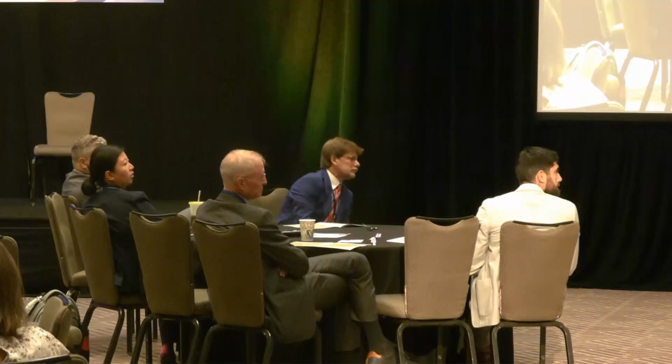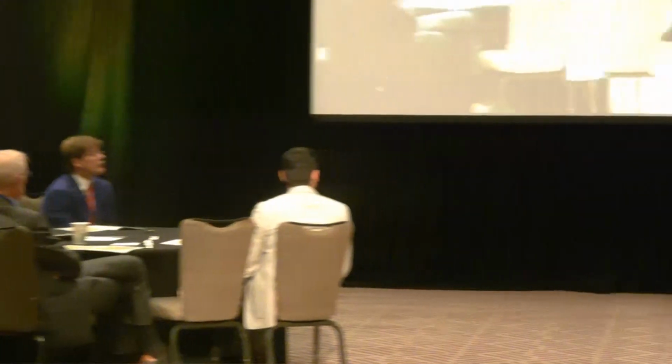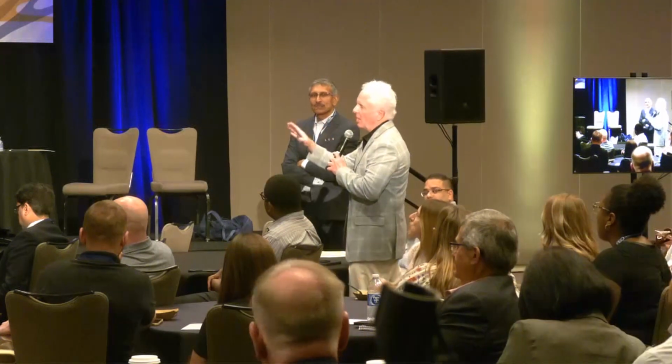So one of the other considerations you have to ask is, why did this occur? Because this is uncommon. I've seen 3 in my career. So what I would have also done, just because of that knowledge, is a bent leg angiogram to see if there's an area where I'm still going to have crushing, because Supera resists fracture, but I don't know if anybody's ever seen somebody sent to them with a popliteal entrapment. They just shatter as well. So you really want to understand why that was occurring in the first place, and sometimes you've got to double treat the area where you're really getting a kink.